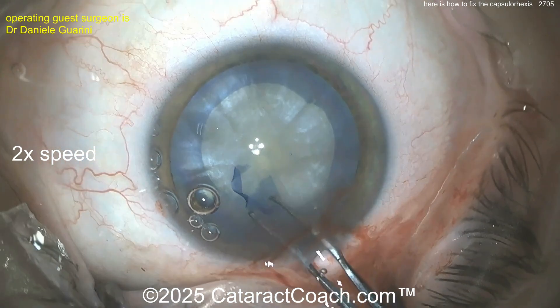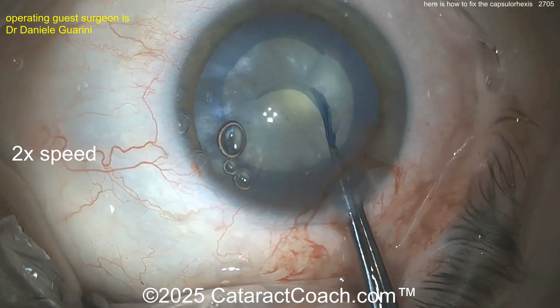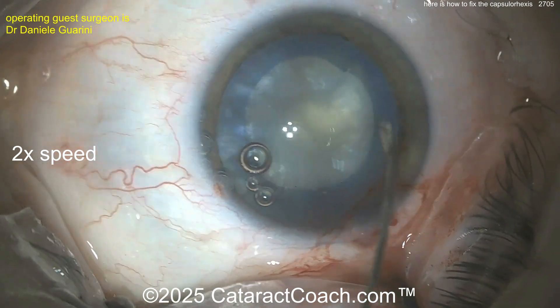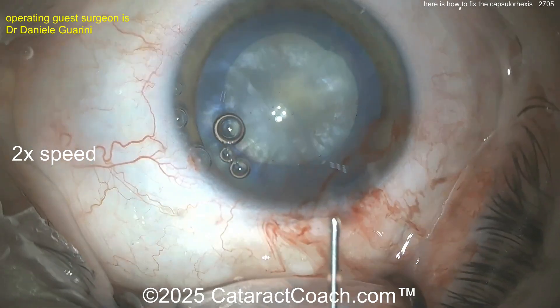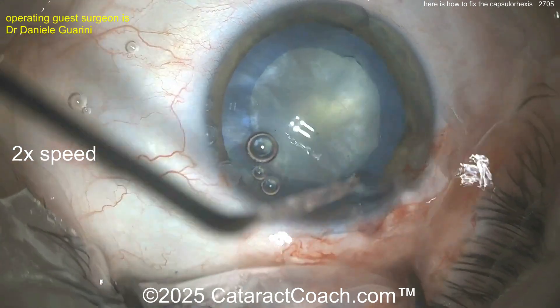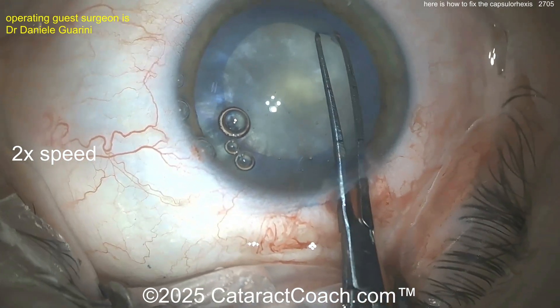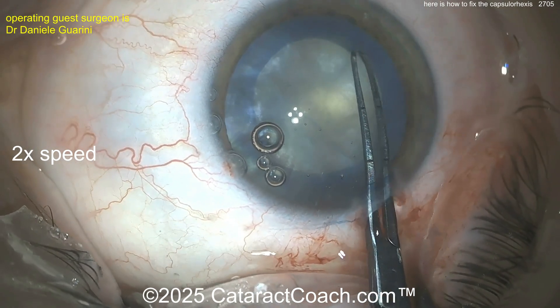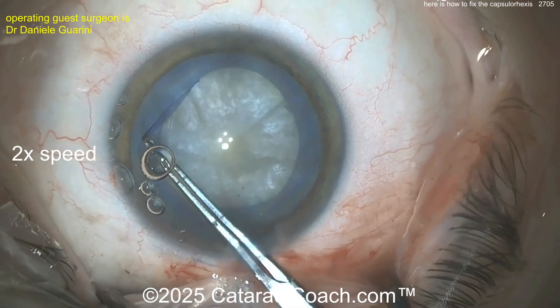Almost done — grab it. Now that is almost beautiful. What's missing? Well, look at the area where the lens capsule — the anterior capsule — is punctured. You see there's still a little runout tag there. You need to grab that and now go anti-clockwise or counterclockwise and just get rid of that one weak spot right there. Grab the left flap and go counterclockwise — as Americans we say counterclockwise — grab it here and go to your left so you don't have a runout. There you go. Now that's enough. Just bring it in.